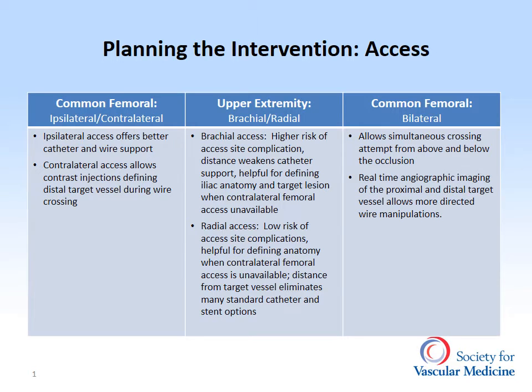There are a number of considerations when planning iliac artery intervention, including vascular access site. Options include a unilateral common femoral approach, an upper extremity approach, and a bilateral common femoral approach. When considering unilateral common femoral approaches, there are ipsilateral and contralateral options.